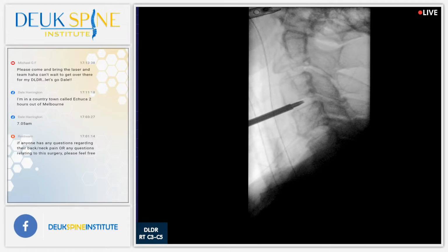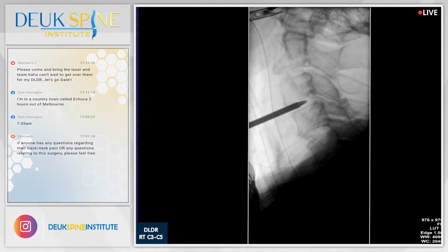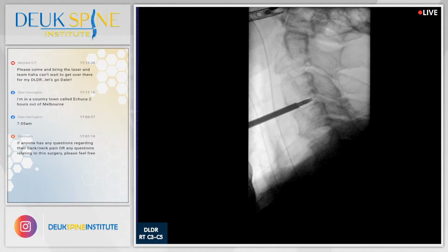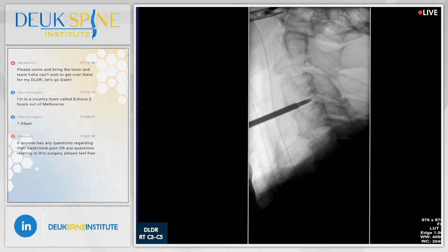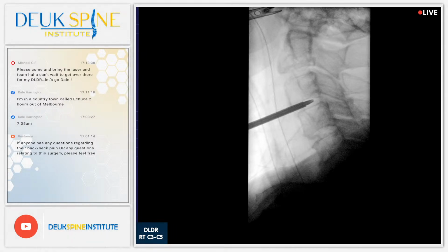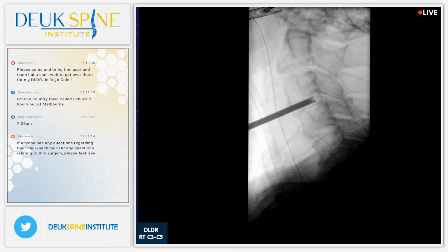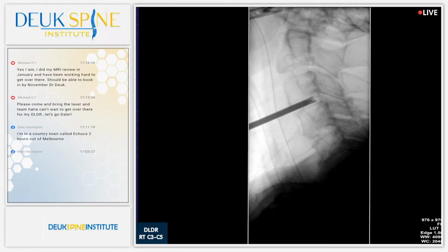Shot. I mean, as I'm hitting it, I'm feeling it bounce back. You give me some more orbit. Your orbit's off. Gosh, the tube's going backwards. I've never seen that. I've seen the dilator go backward. I've never seen the actual tube go backward. Holy smokes. All right, that's as good as we're going to get this.